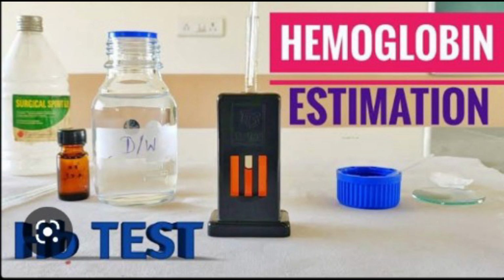Equipment: colorimeter with green filter, 540 nanometer, Sahli pipette, test tubes. Reagents: Drabkin's solution, cyanmethemoglobin standard solution. Composition: potassium cyanide 50 mg, potassium ferricyanide 200 mg, distilled water 1000 ml. Store in a dark bottle at room temperature. Standard solutions with Hb content of 5 grams, 10 grams, 15 grams are recommended.